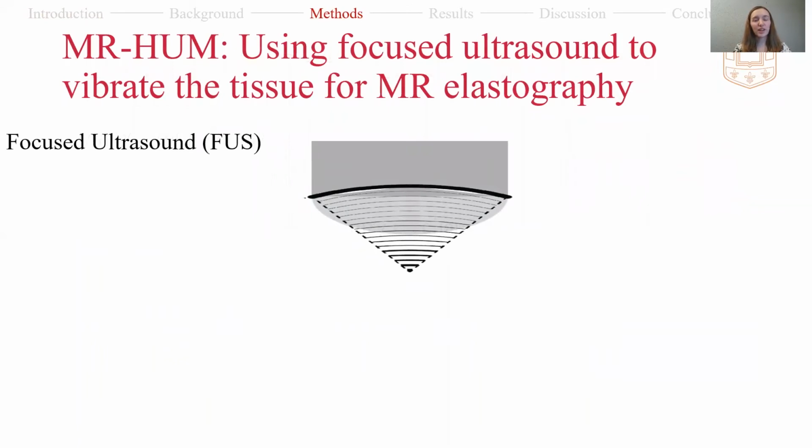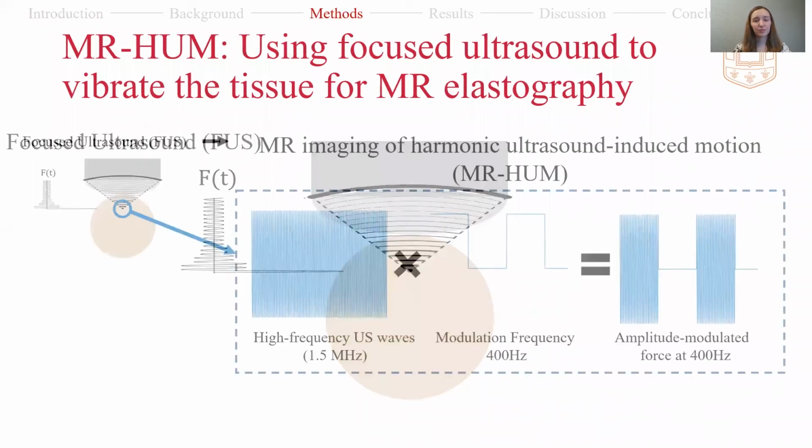One way to characterize anisotropic tissues is to use shear waves, which can be created using ultrasound. Ultrasound waves can be focused into a focal point. At the focal point, the focused ultrasound energy produces a relatively large acoustic radiation force that can move the tissue.